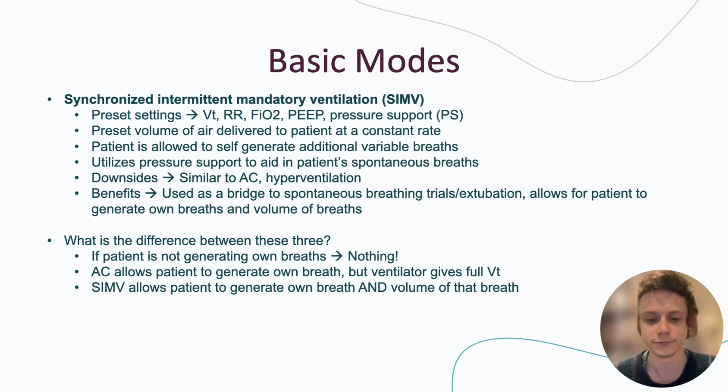Pressure support can be thought of like this: it's very difficult to breathe through an ET tube. It's a tiny little tube down your throat, so it's not very easy to actually breathe out of, as you could imagine. Pressure support aids in giving additional pressure to the breath so that they can overcome the ET tube, making it easier for the patient to do these spontaneous breaths.